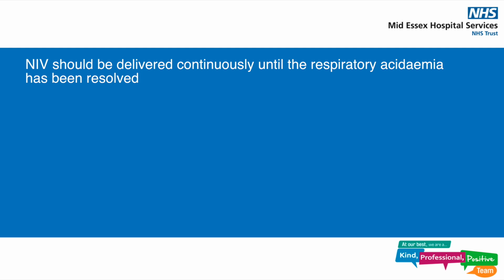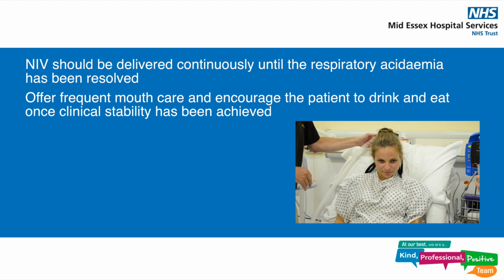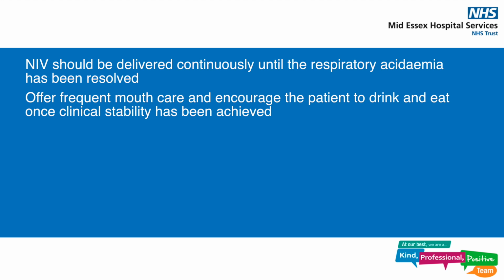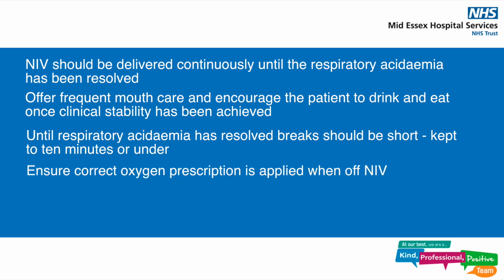NIV should be delivered continuously until the respiratory acidemia has resolved. Offer frequent mouth care and encourage the patient to drink and eat once clinical stability has been achieved. Until respiratory acidemia has resolved, breaks should be short, kept to 10 minutes and under. Ensure correct oxygen prescription is applied when off NIV.